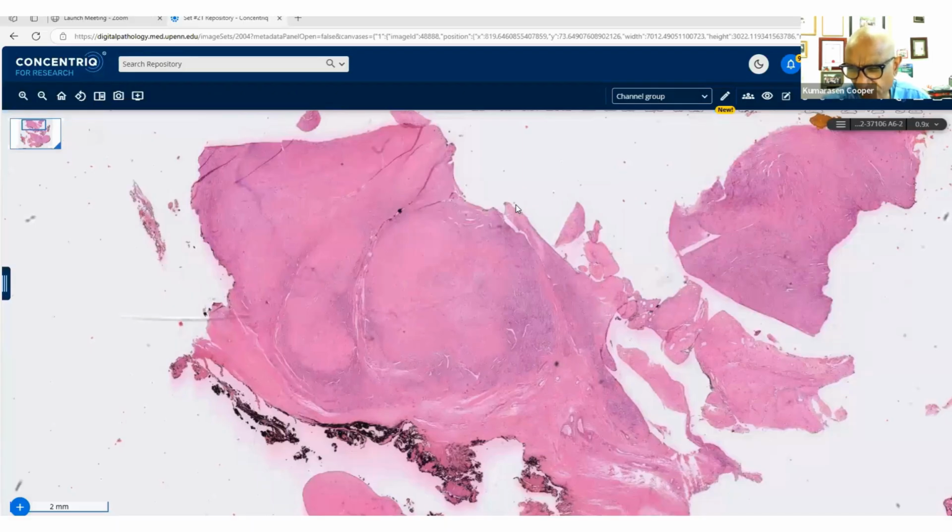And those who've joined me previously will know that the simple plan is that I show an H&E slide, which has been scanned, on my screen, and I give you a history, and then I hope and anticipate you giving me differential diagnoses, which we talk about, and any other investigations that come up. We talk about any aspects that do come up, and that's the way we proceed. So it's a simple interactive procedure, which helps two-way communication.